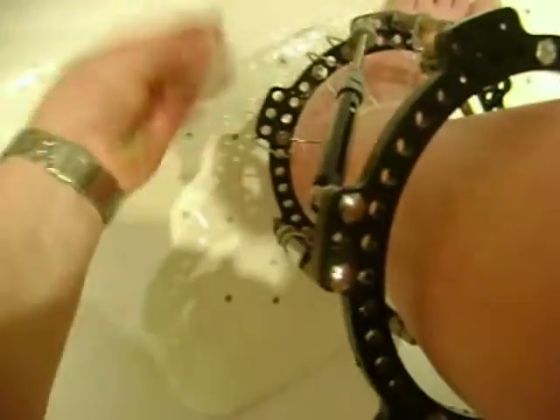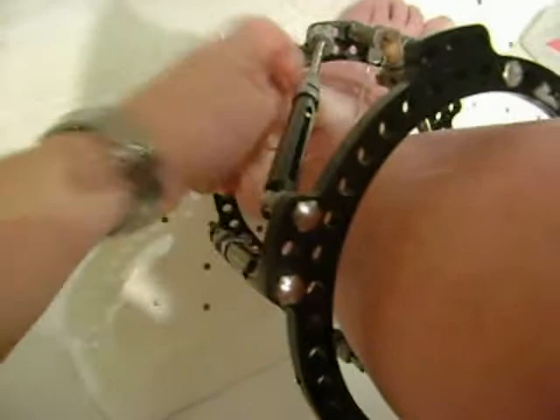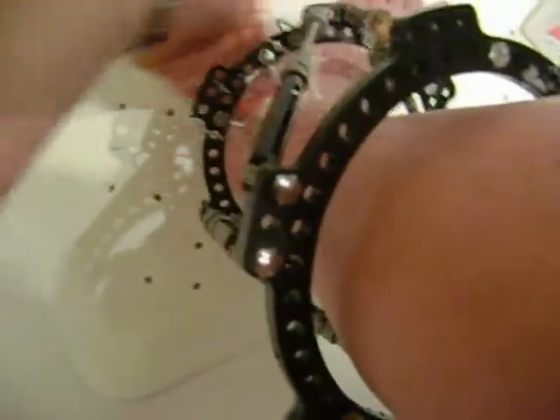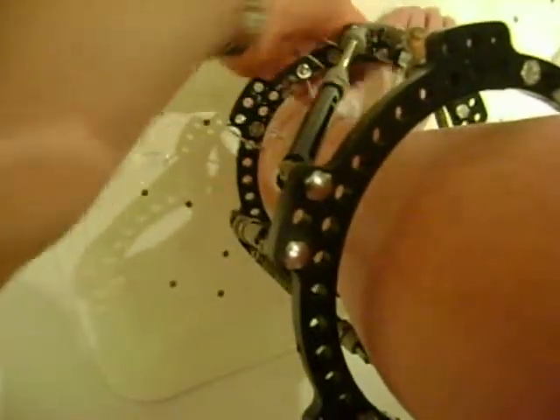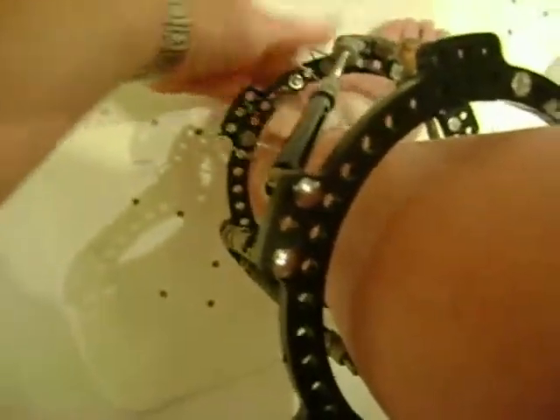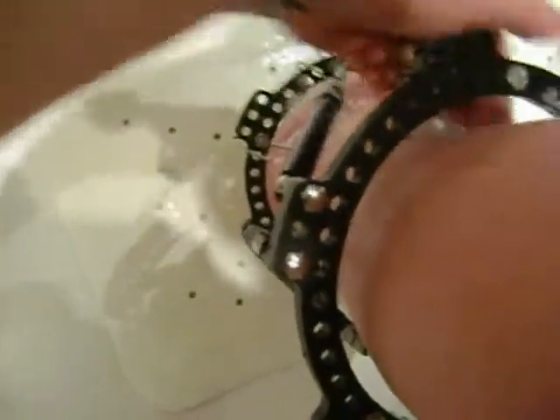I've never had a complaint from the hospital, so I must be doing something right, and I've not had a pin site infection at all. So it's working for me, and hopefully if you're unfortunate enough to be in the same position, it might work for you as well. That's just a short update on how I'm now cleaning the pins up until the point when the frame comes off. I'm going to sign off now because I'm going to get in the shower and wash it all off.